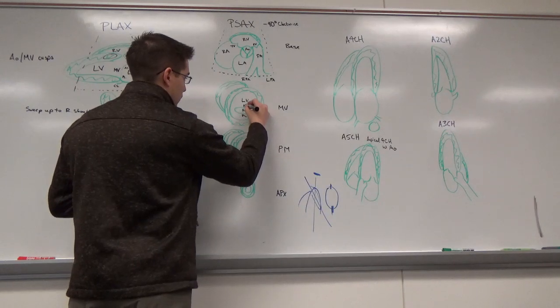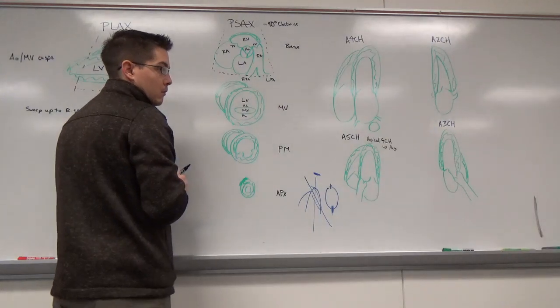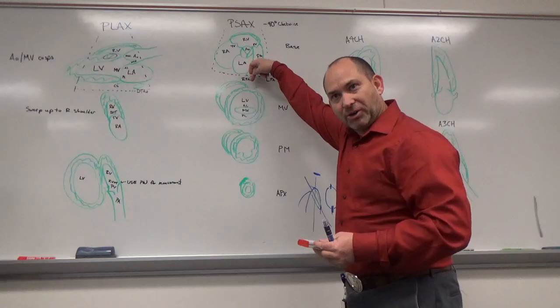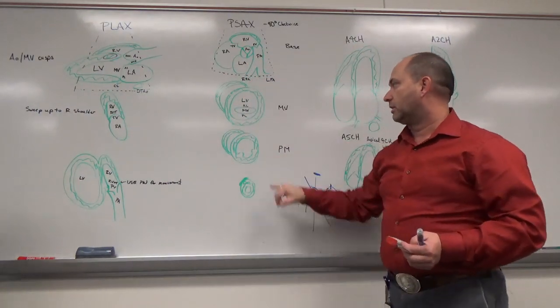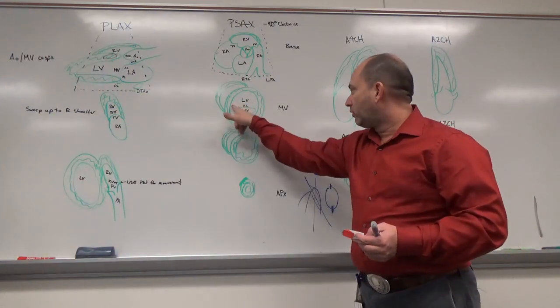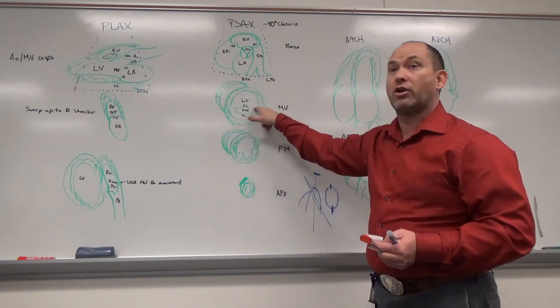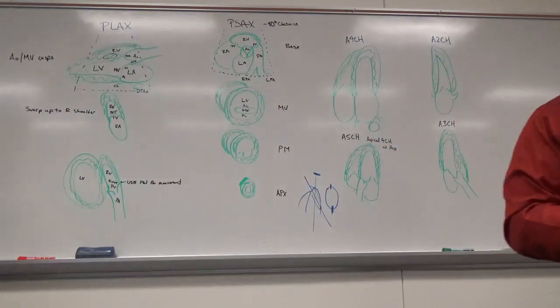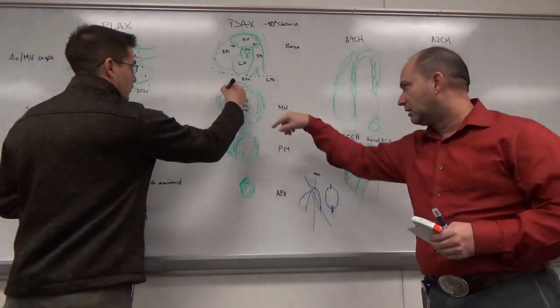So anterior, posterior, do you agree? Yeah. You sure? Yeah, just checking. So the transducer's anterior. The first one we hit is the anterior mitral valve leaflet. The second one is the posterior leaflet. This is actually a bigger valve. It's longer, but the posterior valve actually wraps more around, so it's longer around this way, but it's shorter. A lot of the issues come with the anterior mitral valve leaflet, just FYI. So we're looking at the very tips of it to see that.